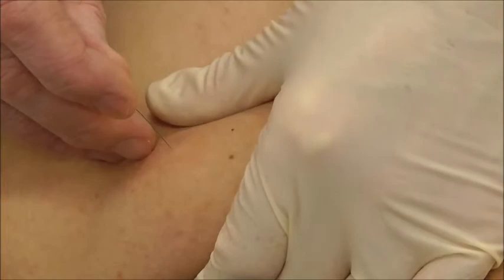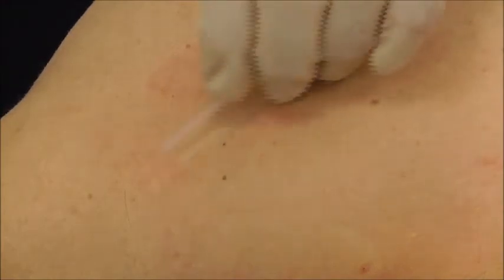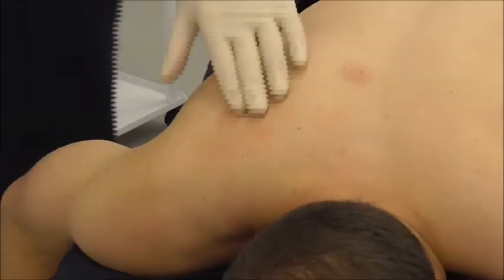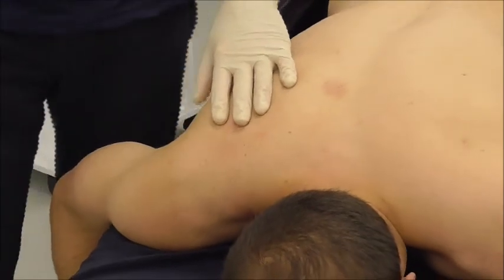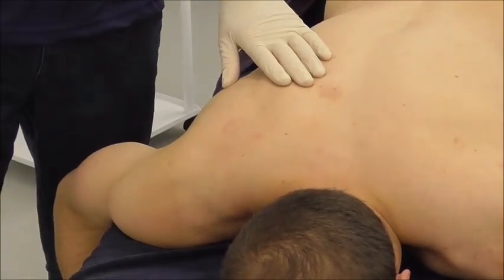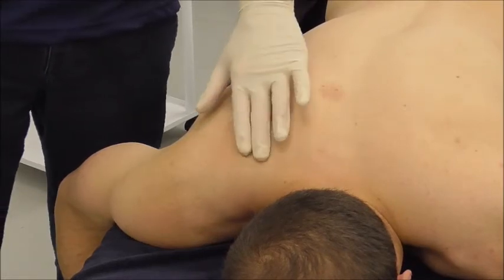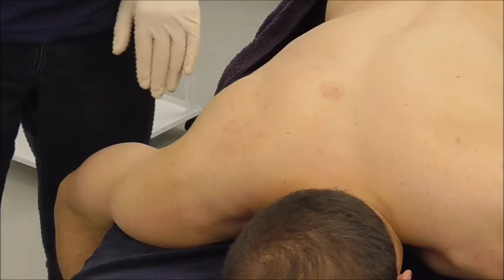Withdraw the needle, releasing once the needle tip approaches the surface, then take the needle out. Inspect the area before the subject moves. Normally we can expect the subject to react to the needling, so tell him to sit up or stand up slowly — he may feel a little light-headed, so just be cautious. That covers our supraspinatus and our trapezius.